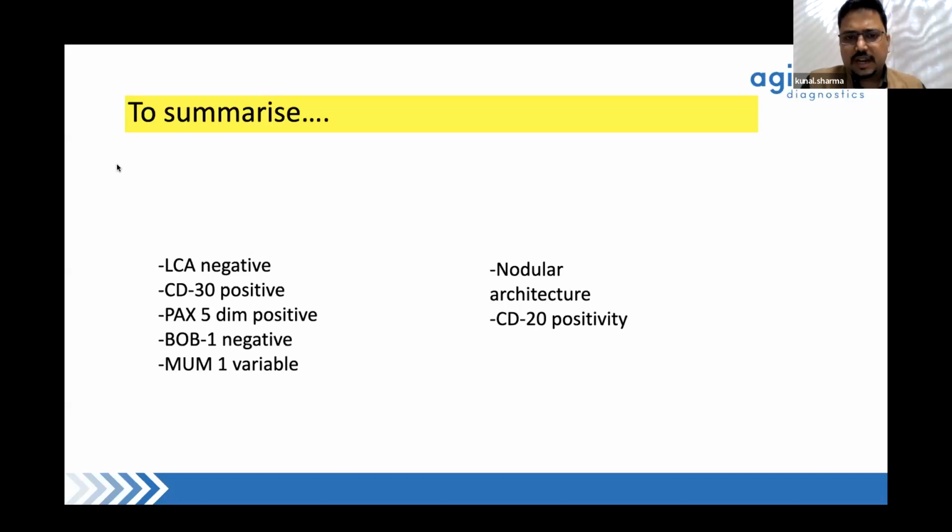Dr. Arun, another question is, can treatment change the immunophenotype? Yes, post-rituximab can change the phenotypic expression of the B cells, but here there was only radiotherapy. There was no chemotherapy before excision of the lymph nodes. As Sunita ma'am has also said, there is sometimes a change in immunophenotype after treatment, but mostly you could actually see transformations in cases which show a lot of relapses. So one has to be careful about that.